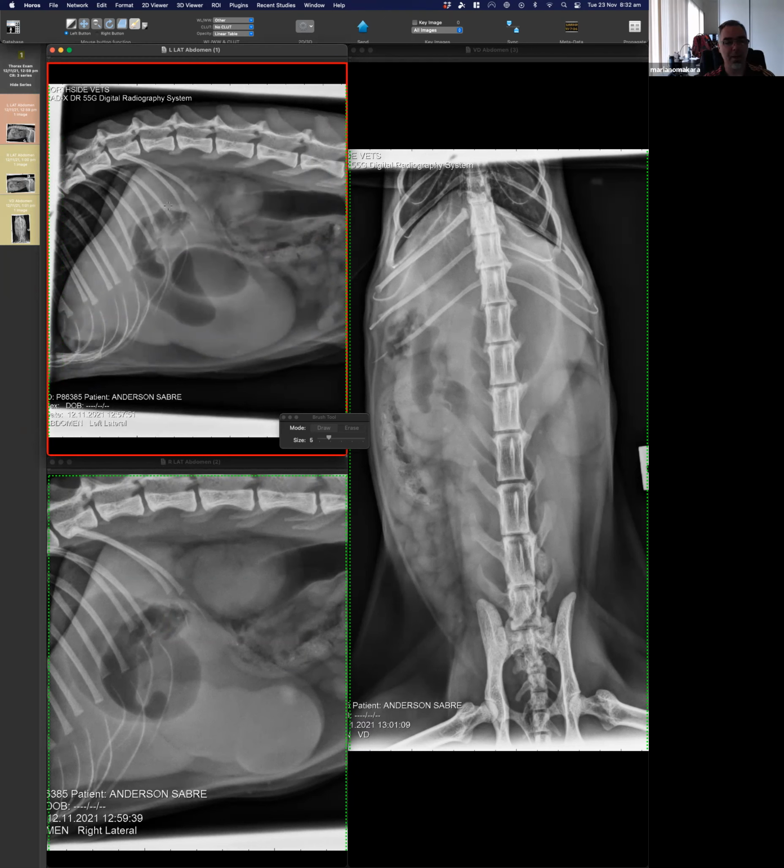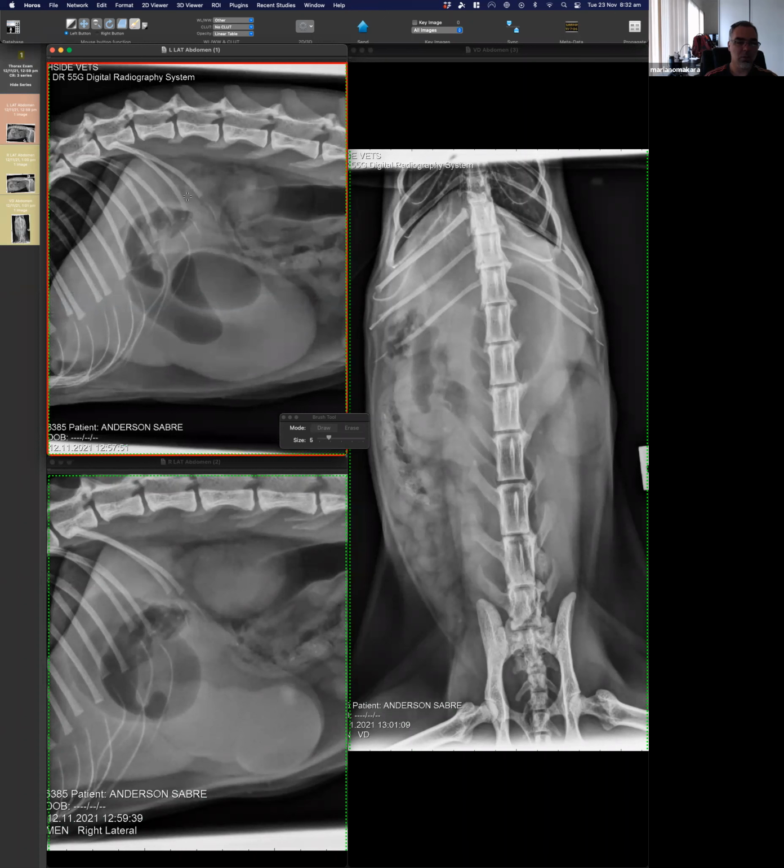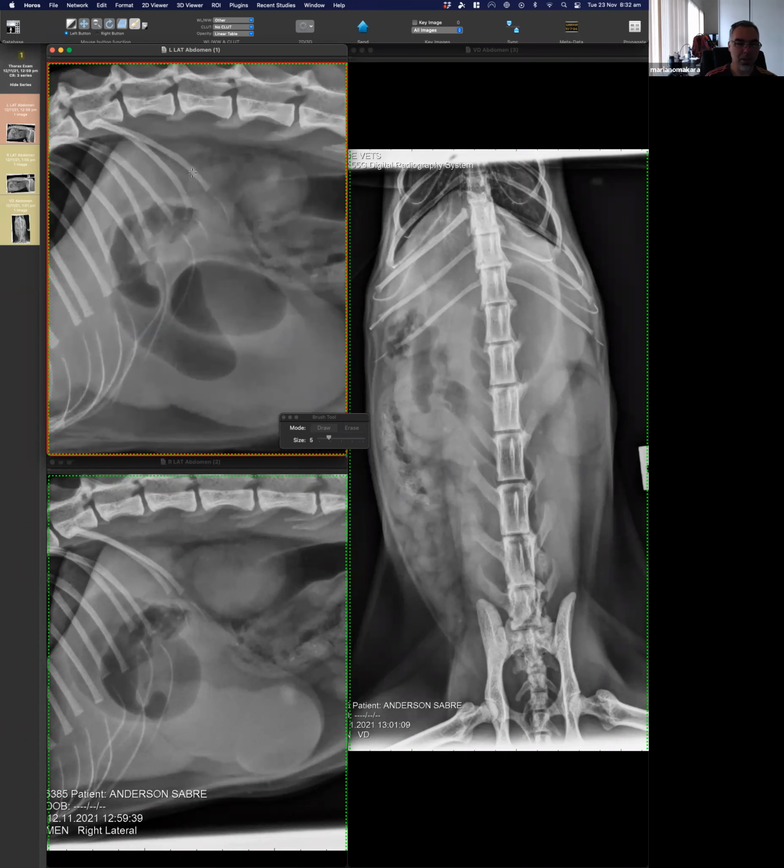They went endoscopically because I remember talking to a clinician saying, you know, I don't know if you're going to be able to get that far. I don't think it's in the pylorus. I think it's in the proximal duodenum, but I'll give it a go. And then she was very, very good. She managed to get there and grab that foreign body. The problem was that when she pulled from the foreign body, the wall was kind of folding upon itself. So it seems that the foreign body couldn't be slid back into the stomach. It was kind of trapped. So then they needed to go in surgically and kind of milk it back into the stomach.